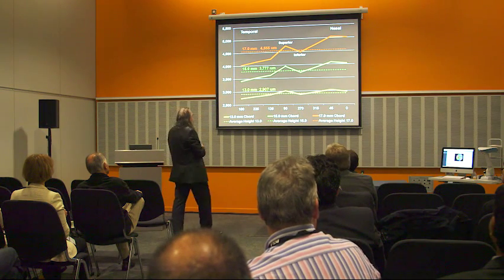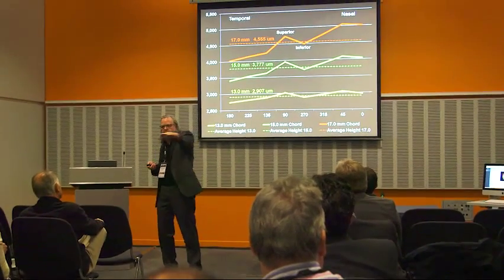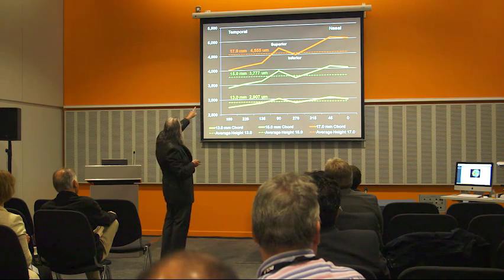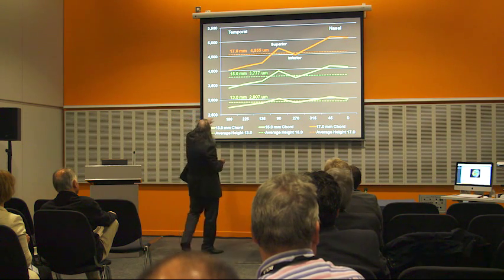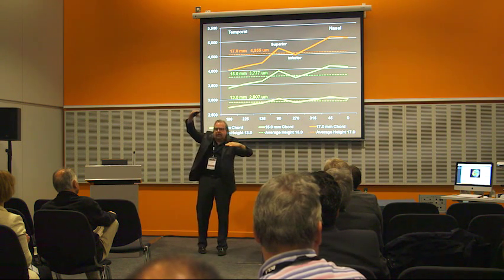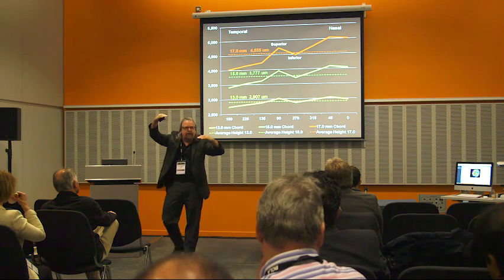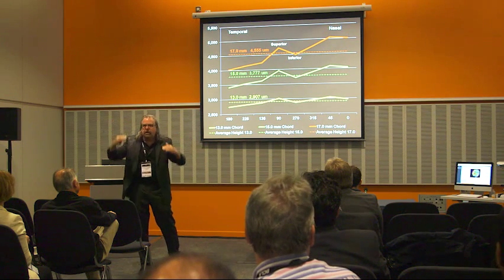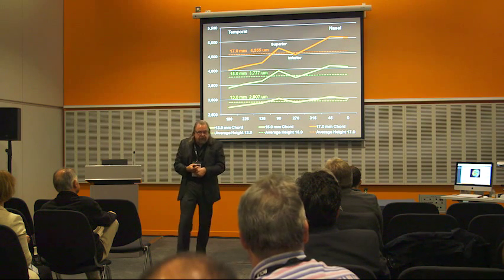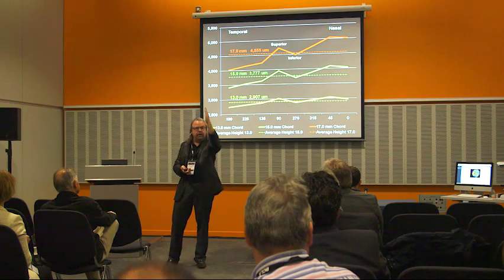That is the shape of the sclera along the horizontal and vertical meridians. You can see on the temporal side, it is fairly low, and on the nasal side, it's fairly high. So the sclera is surprisingly asymmetric along the horizontal meridian, but very symmetric along the vertical meridian.